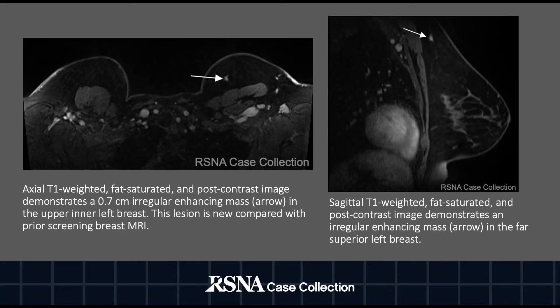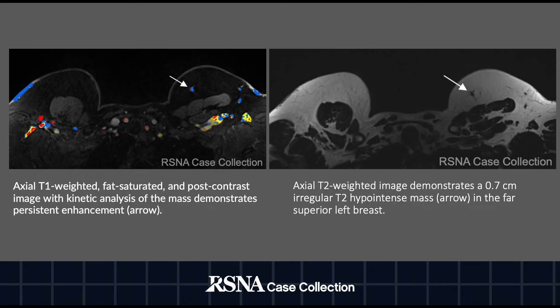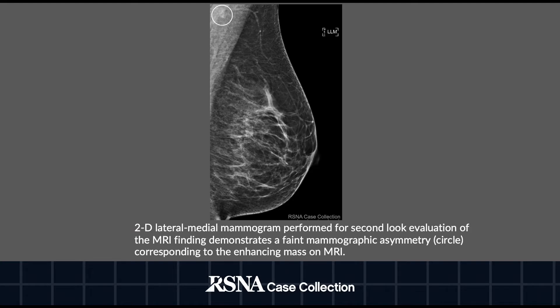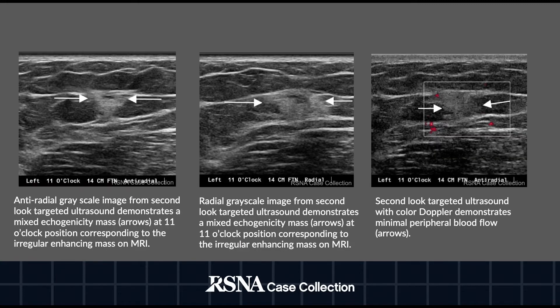Her screening breast MRI demonstrated a new 0.7 cm irregular enhancing mass in the upper inner left breast. The mass showed persistent enhancement kinetics and T2 signal hypointensity. Following the screening breast MRI, MRI-directed diagnostic mammogram and ultrasound were performed. Mammogram demonstrated a faint asymmetry only visualized on the LM and MLO views. Ultrasound demonstrated a mixed echogenicity mass with minimal peripheral blood flow corresponding to the irregular enhancing mass on MRI.